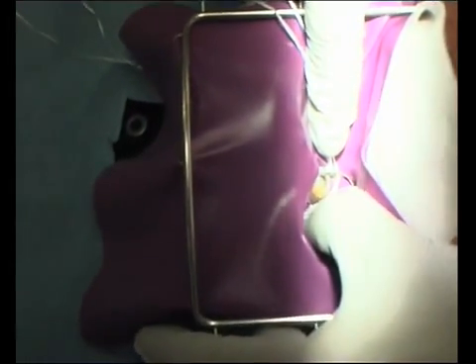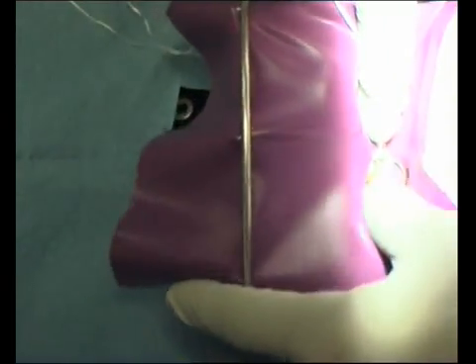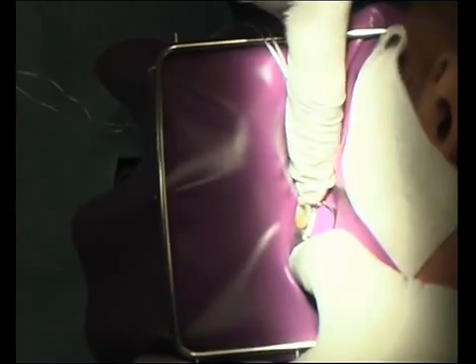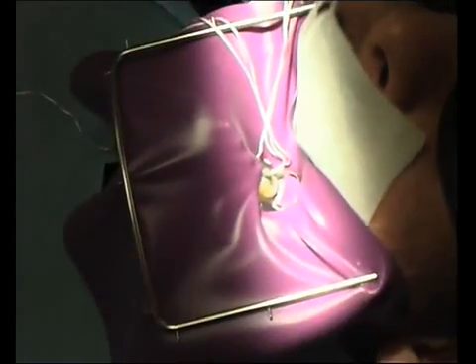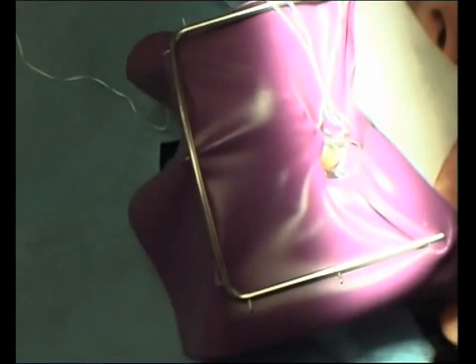The next thing is to then take the rubber dam over the side — so that's under the wing and on the lingual side here. There we are. So that's in place there. We've got a bit of floss actually — is that okay or is it pushing on your gum?